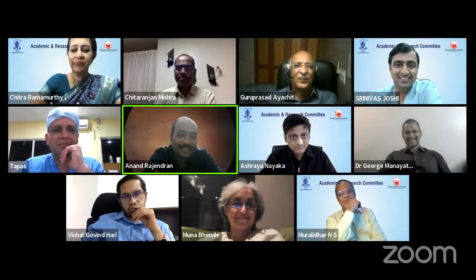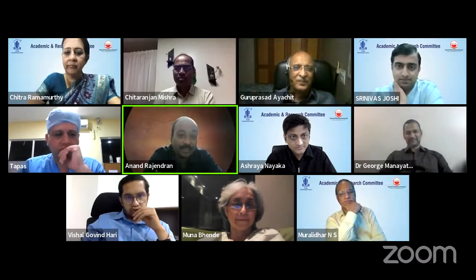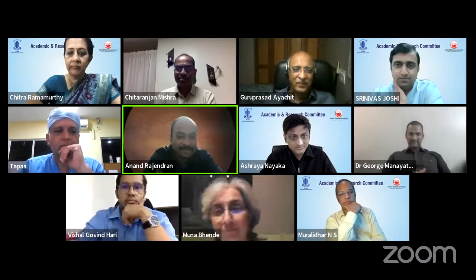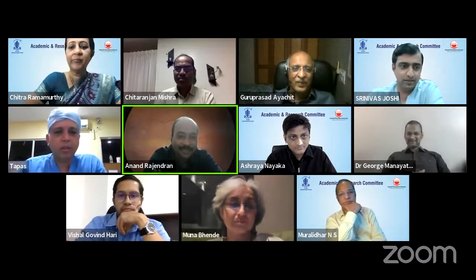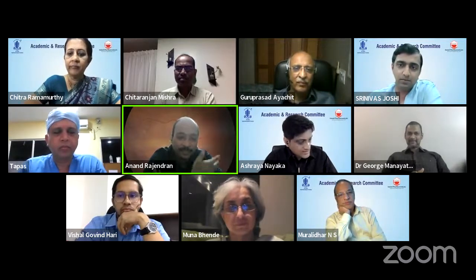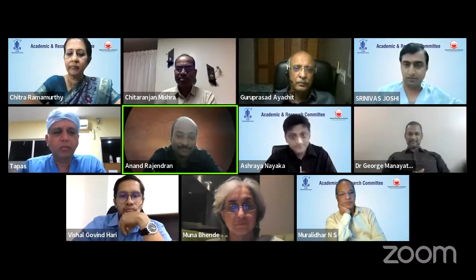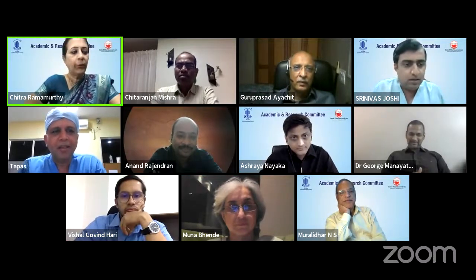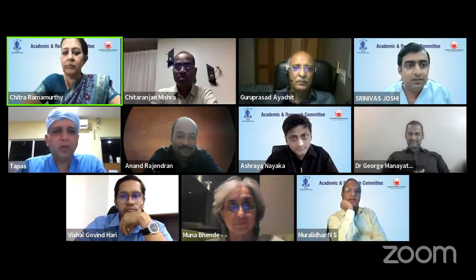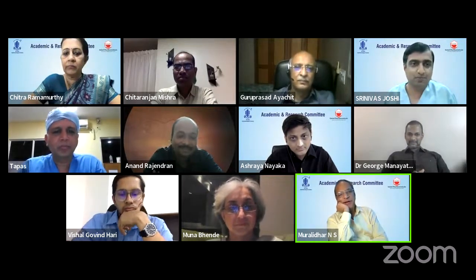Yes, I agree. I think red-free is great for your superficial retinal pathology, especially vitreoretinal interface pathologies. And I think you've mentioned that multicolor imaging is a great tool to look at all three layers, all three depths of imaging. But I would reserve it for the VR interface. Basically, red-free is for the retina, retinal vascular lesions. It's really good and really helpful.